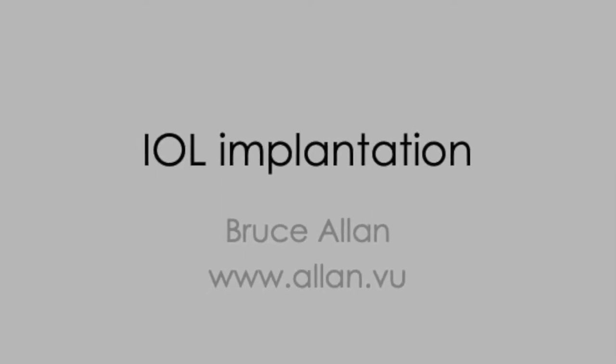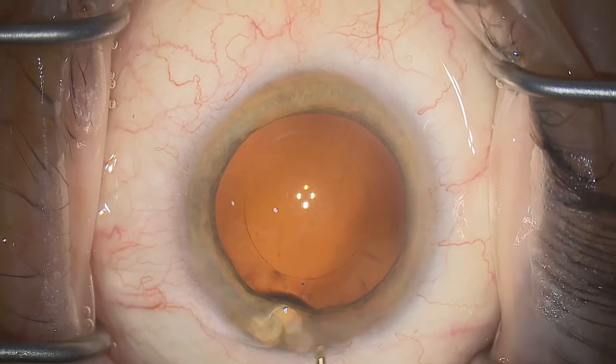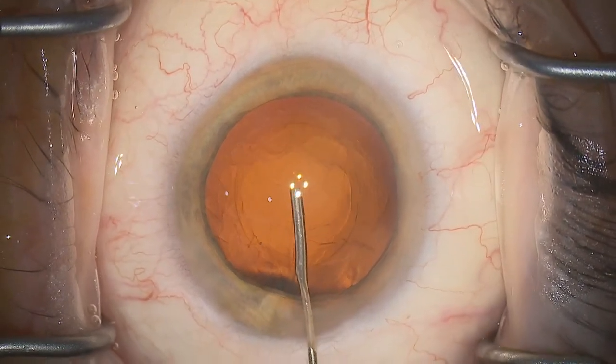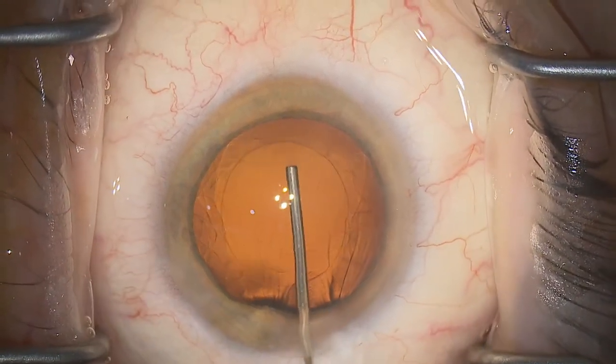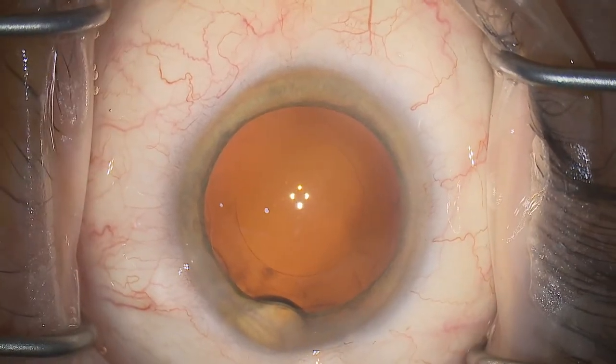In this video we're going to cover a few tips on safe intraocular lens implantation. I would recommend using cohesive viscoelastic over techniques used without viscoelastic — it's super safe and easy to remove.